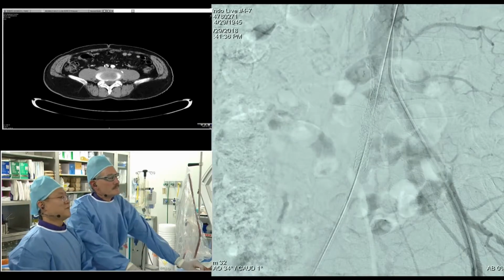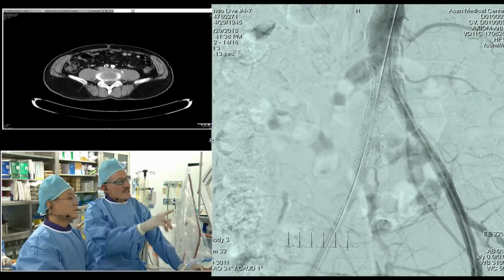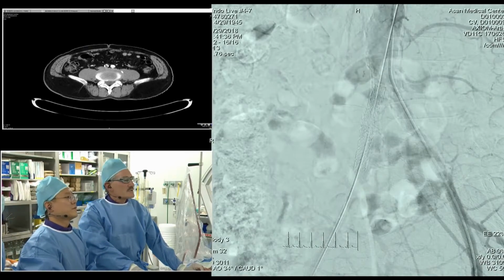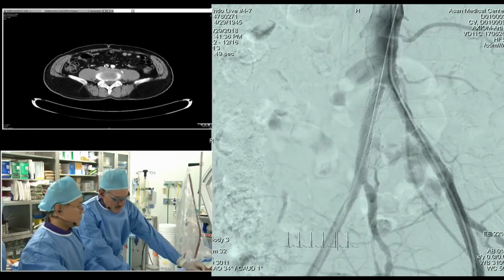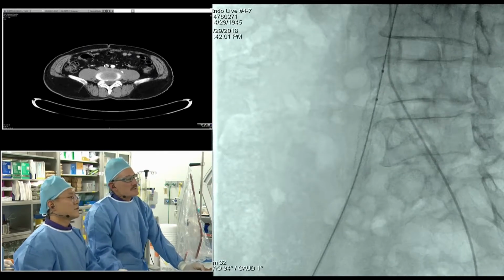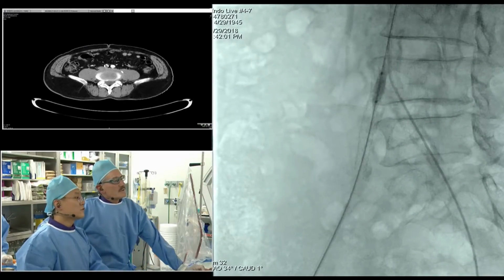It's quite nice. Looking very nice. I'd say at the ostium, there's a little plaque override at the very top, even though we're above the carina. You see that? There's a little lucency at the very top. I think that's just some residual plaque. I'm just going to dilate the ostium one more time to make sure the path is completely clear, and then we'll call it a day. Did you see that? The little lucency right at this proximal stent edge. All right, you can go up here. Let's go up to like 10.